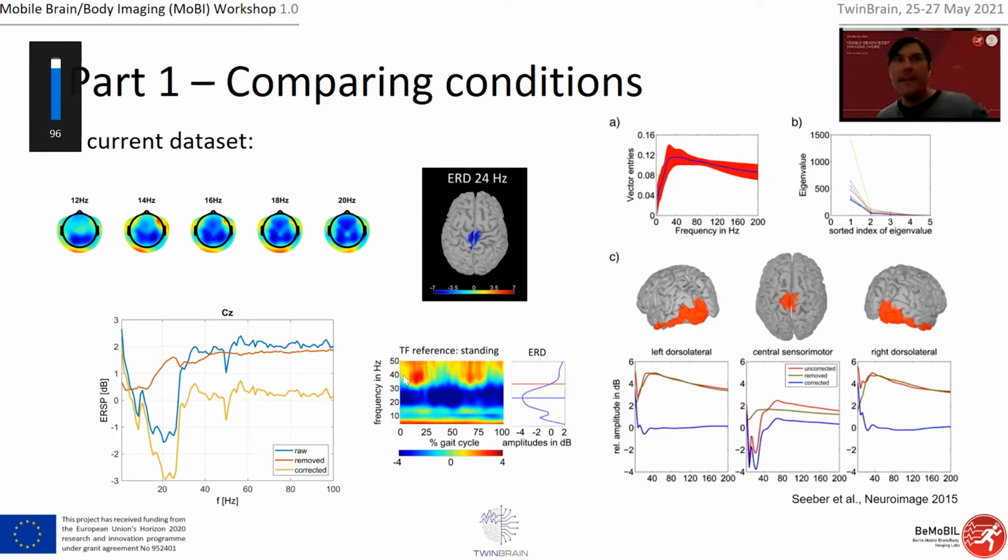The PCA? Yeah, that's an excellent question. I think it won't be so nice because the ICs are really affecting things, especially the eye blinks are really changing a lot, although they are in lower frequencies. But I think the reason why it's quite robust is because there's the averaging before, you know.